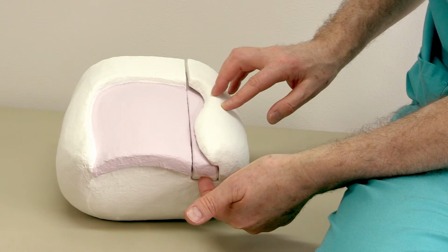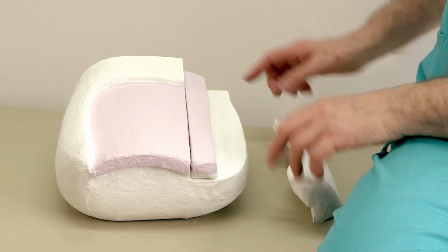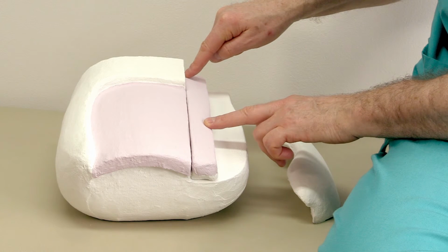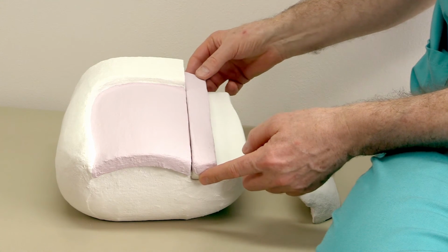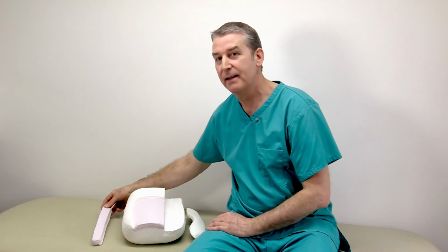A cut is made in the nail plate parallel to the side of the toe. The cut is continued under the cuticle with a fine blade, so we don't need to cut the cuticle. The now loose nail section is then rotated inwards towards the centre of the toe. That's most of the procedure done.